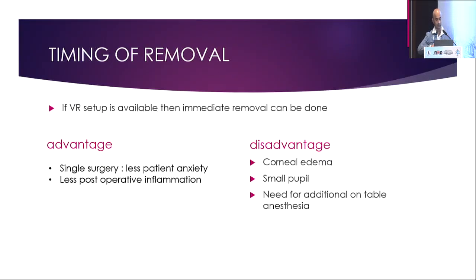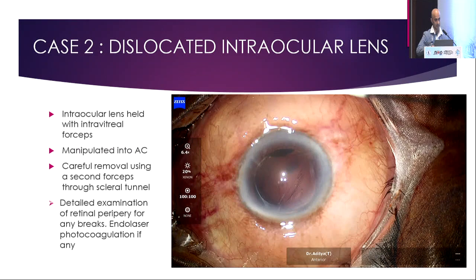So as I said, the timing of this nucleus removal is very important. In our scenario, we do have the VR setup available immediately, and therefore we try to do it at the same sitting itself. So the advantage is obviously a single surgery, so the patient has less anxiety about this. At the same time, the disadvantages are post-operative corneal edema, small pupil, and need for additional on-table anesthesia, which can be another drawback as such, you can say.